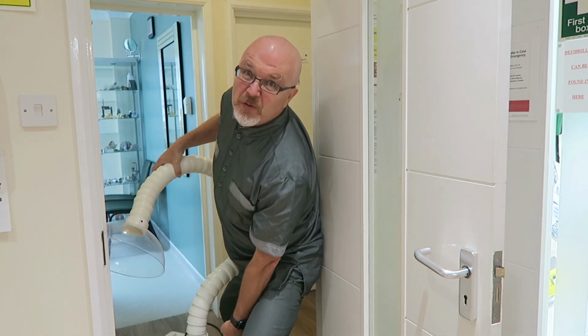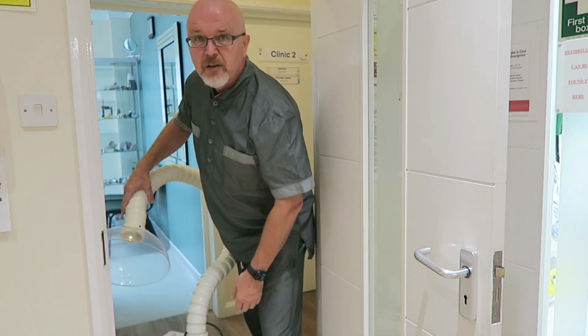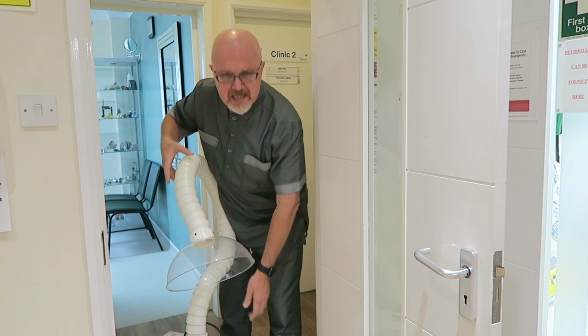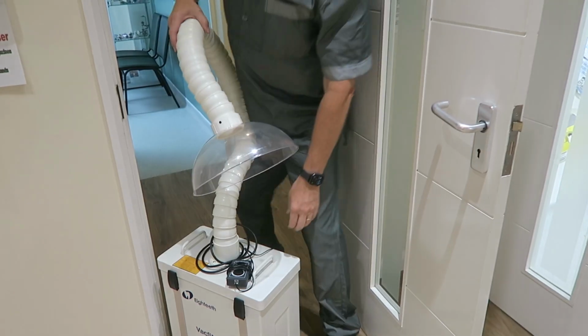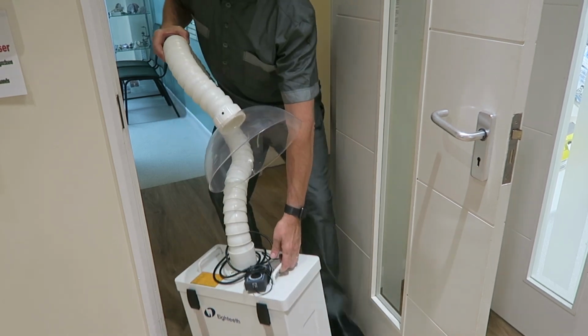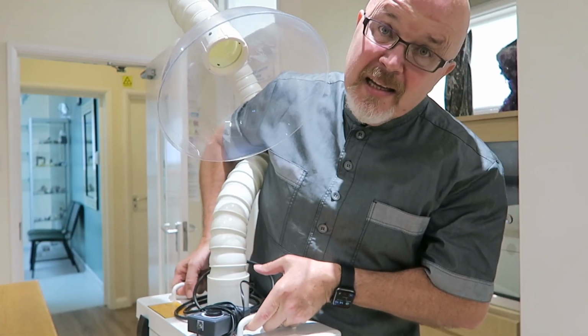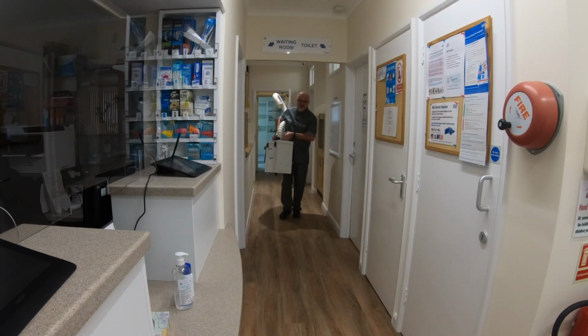Right, I thought I'd just show you moving between the surgeries. Got the VacStation here. As I said, it's only got wheels on one end. So I lift this up, and we can wheel that along like that. A little bit awkward. So in the main, I tend to pick this up. It's a little bit unwieldy, but it's doable.